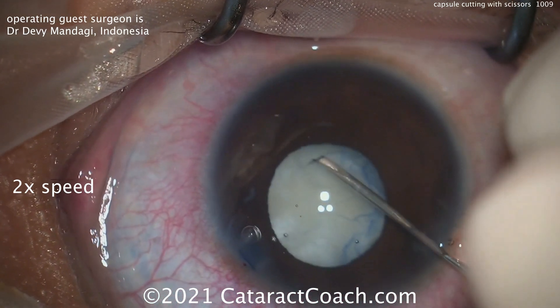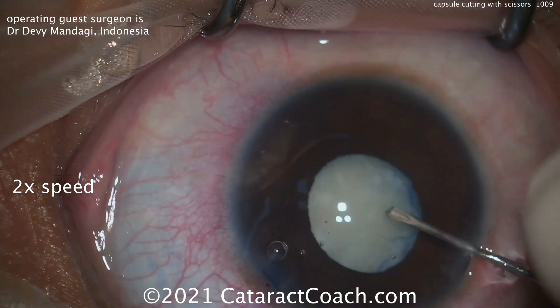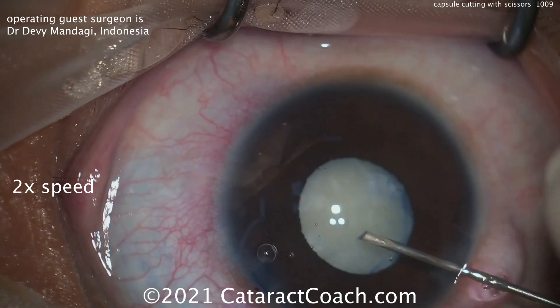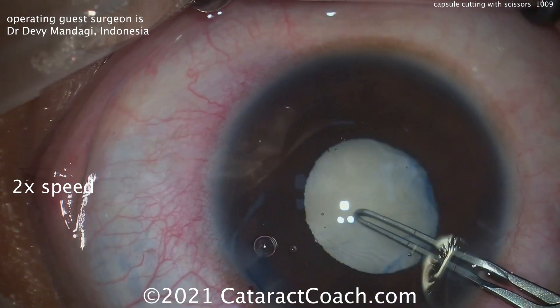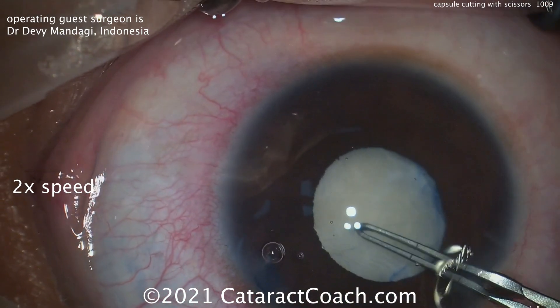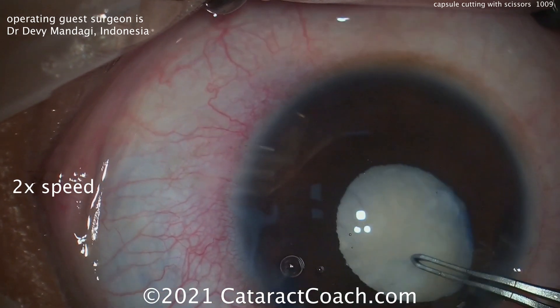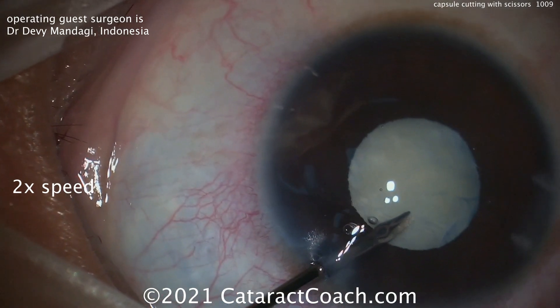Take a look at this fibrotic white lens. The capsule is so wrinkled and fibrotic — you can poke in with the cystotome, but it's impossible to get it flipped over. Grabbing with the forceps to try again, and this is after staining with Trypan Blue Dye, it just becomes very difficult to see what's going on. As you try to tear it, it looks like it's going to compromise the zonular support.